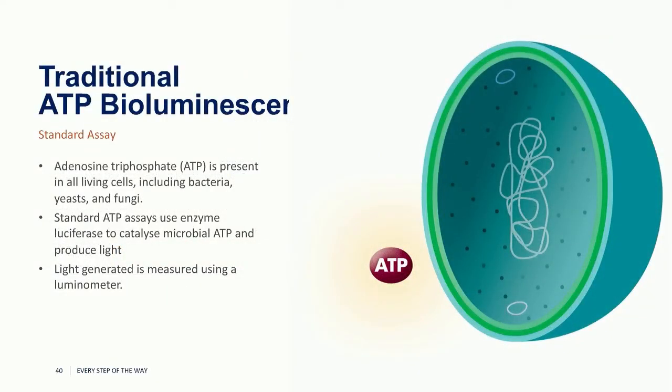And so just to give a quick overview of this, there are different platforms out there that utilize ATP bioluminescence. If we think back to traditional ATP bioluminescence, maybe everybody can remember from school days that this is an enzymatic reaction that has been understood for quite some time. This is not something that any of the ATP platform manufacturers has invented.